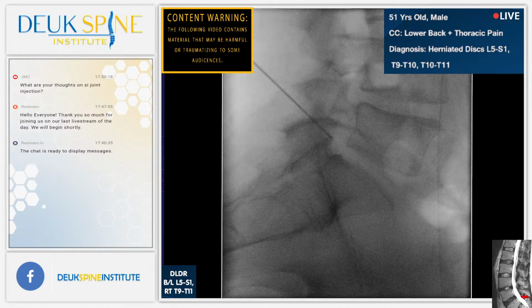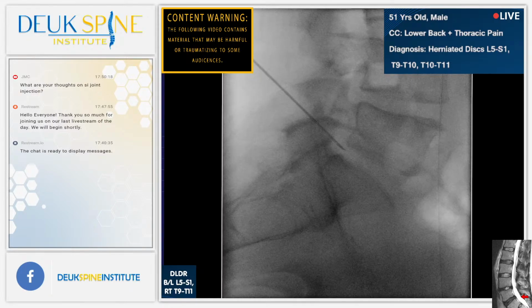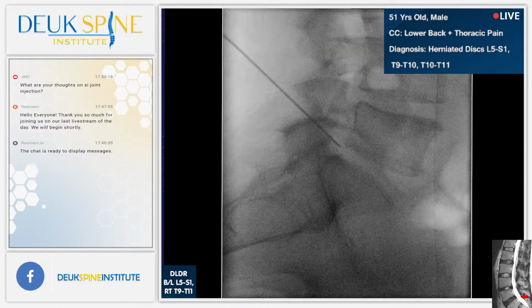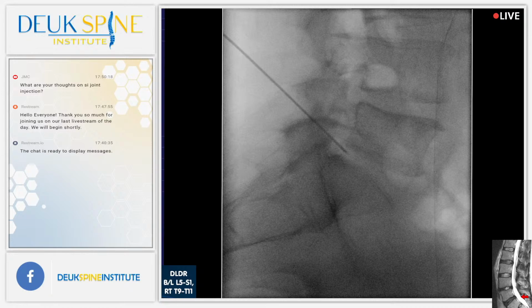Say, no, hold on. Shot. Okay, AP. That's the best we've been so far. Gotta say, this is very unusual. You can see his pedicle. Show the pedicle 5. Well, next time. It's too late now. Shot. That feels like the herniation right there.